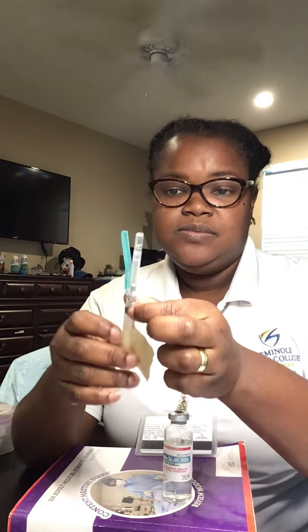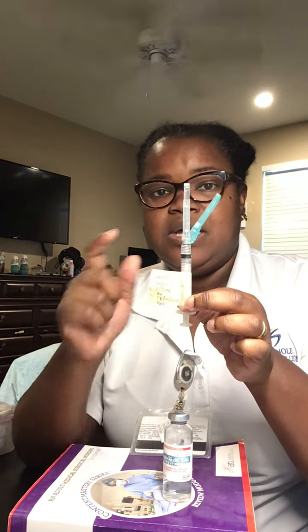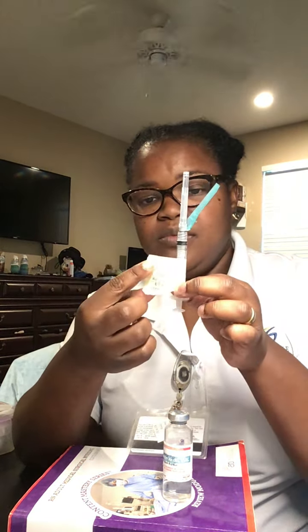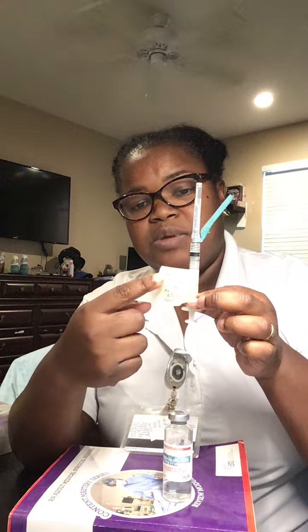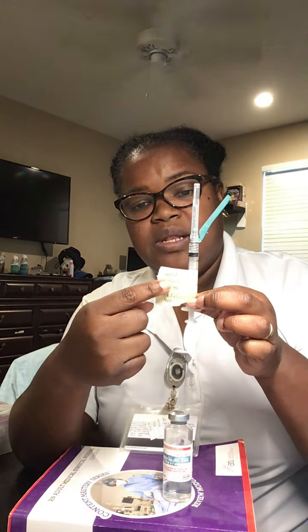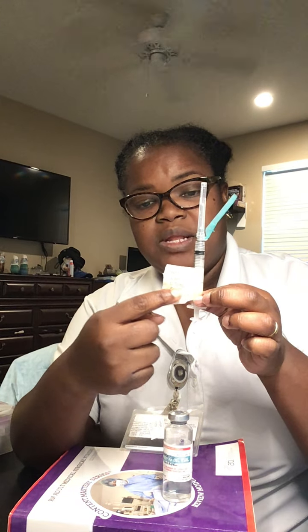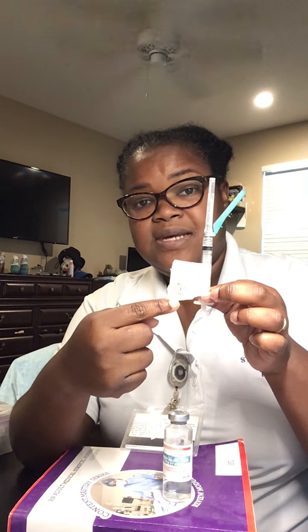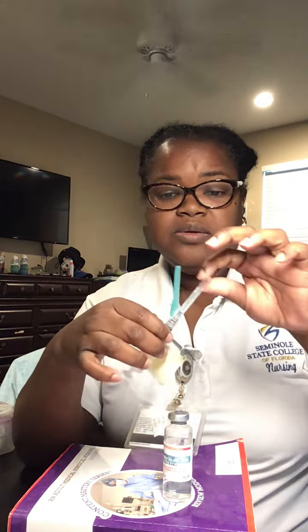Okay, now I'm going to start with the influenza. When I finish doing that, I have to label the syringe. I have to put my patient's name, then the name of the medicine I'm going to give, the amount is 0.5 ml, my initials, the day and the time I'm going to give it. This is 1600. I'm going to start the process to fill up my injections.